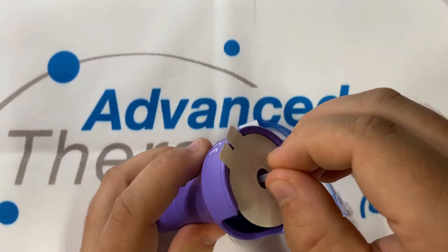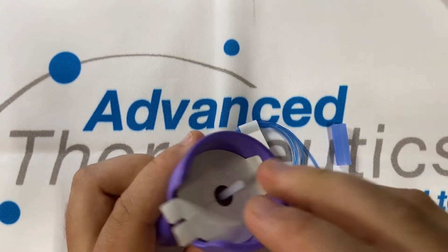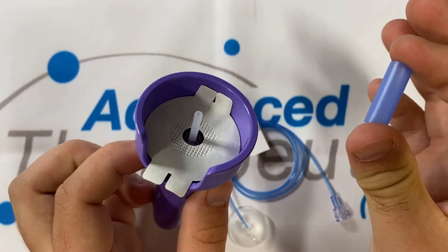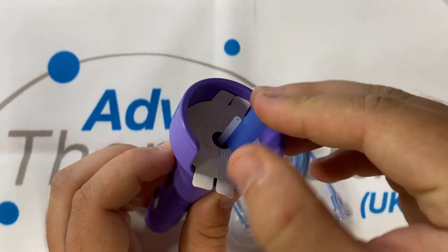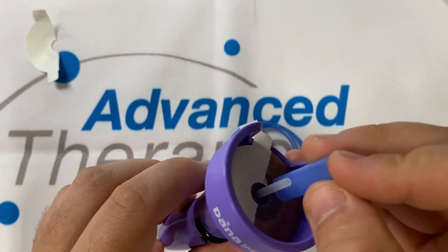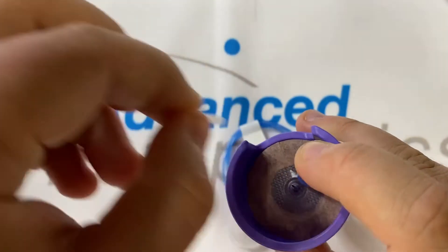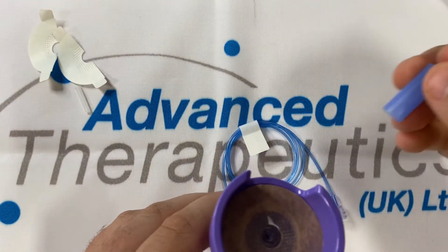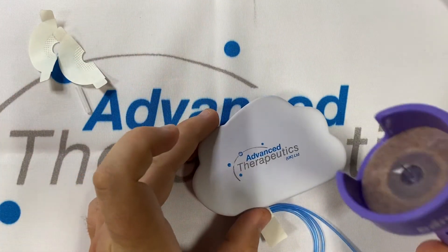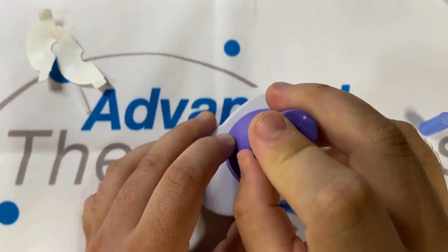Inserting a cannula is as easy as clicking the cannula into the inserter, sliding on the lock to prevent accidental firing, getting your small blue cylinder and applying some pressure to make it easy to remove the sticky back plaster. Remove the introducer needle cover, find the patch of skin that you'd like to use, slide off the lock and fire.